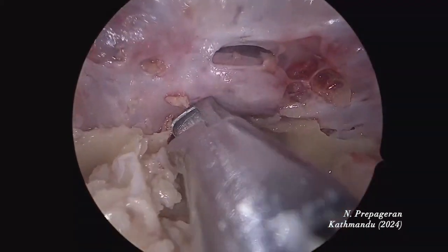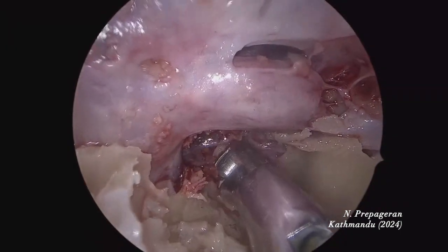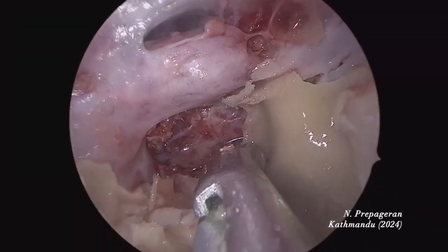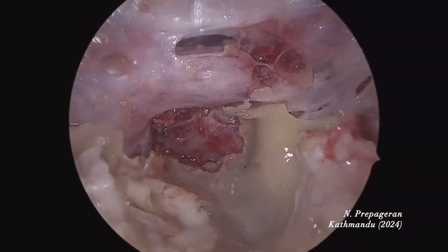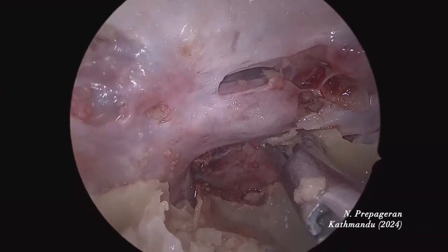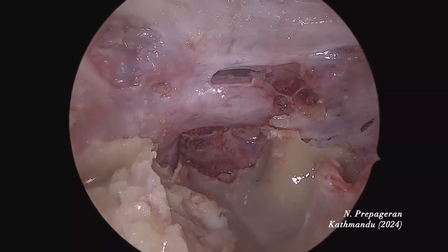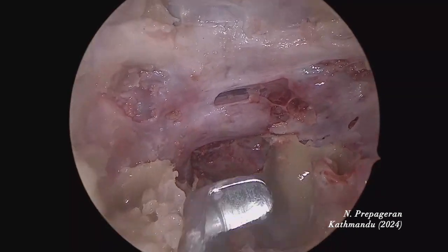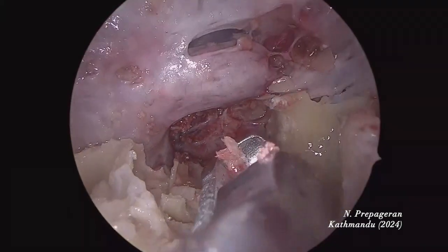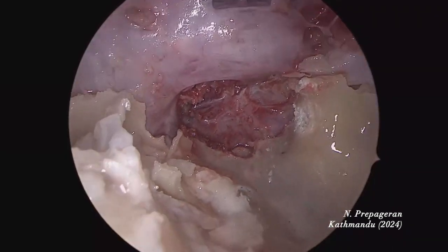Go until you expose the paraclival level. There's a paraclival level already being exposed. I'm going to open now. Don't get me wrong — I'm not saying don't use a drill. Use a drill when you really have to. But be versatile — that's the right word. You must be able to manage with whatever you have. Life doesn't give you everything you want, especially if you operate outside your comfort zone.